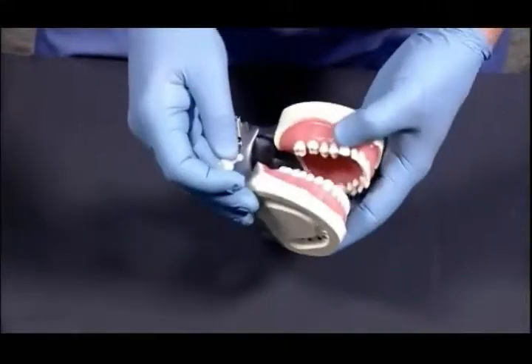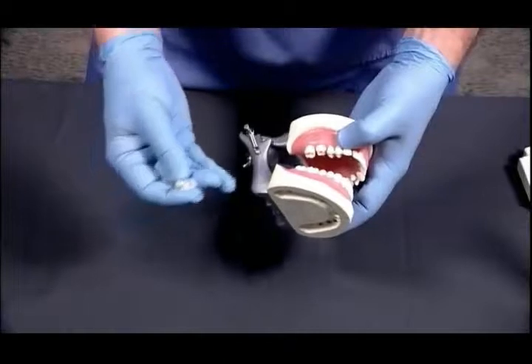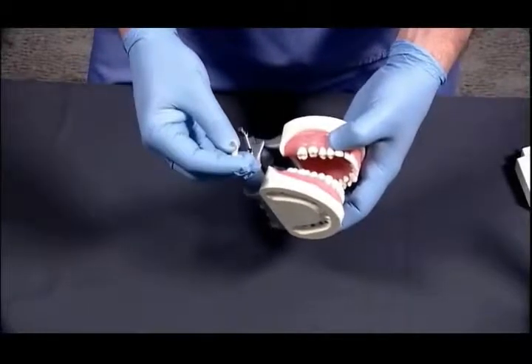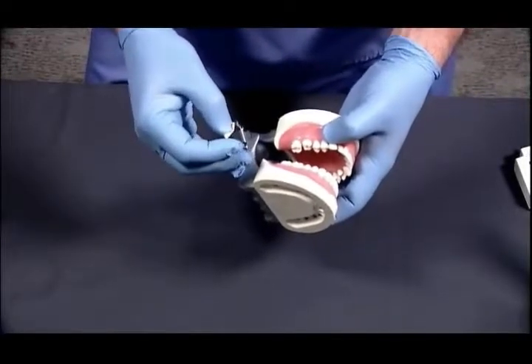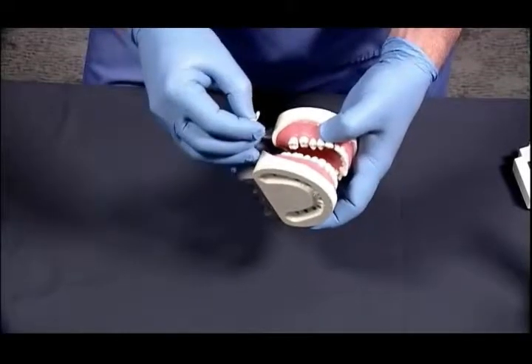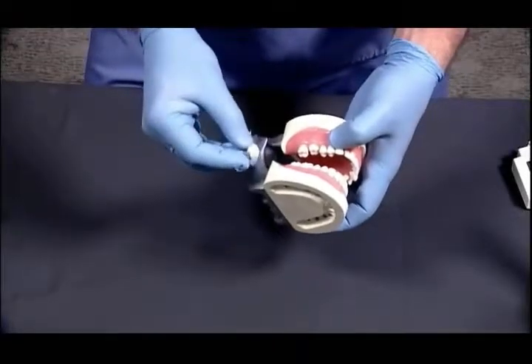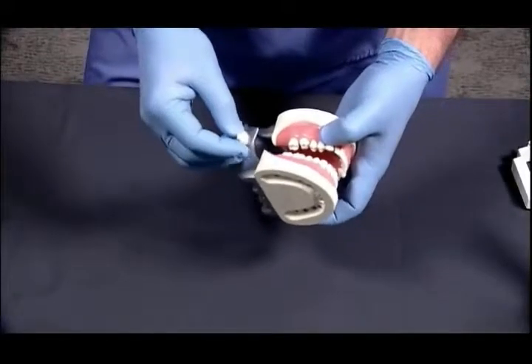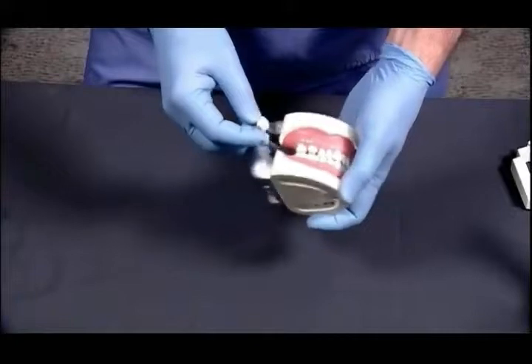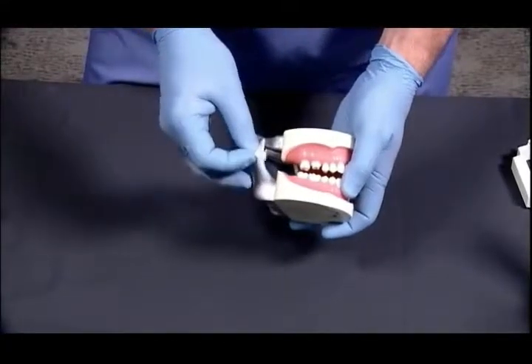And from that preparation, we'll be taking an impression, going through fitting a crown shell onto the preparation and onto a model of the preparation. And from there, we'll be fabricating extraorally the crown for final delivery to the patient. The patient we'll be utilizing today is an articulator, so it's for demonstration purposes only.